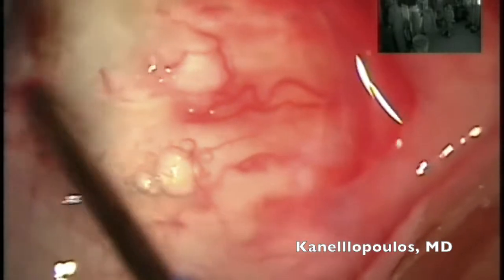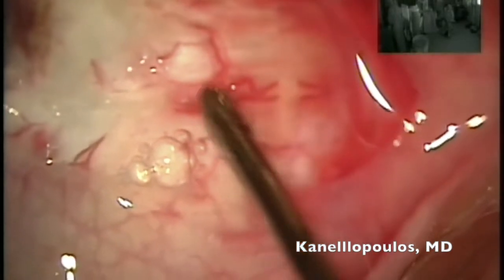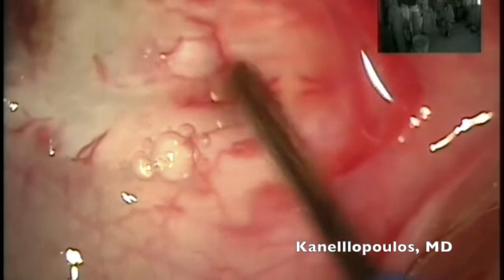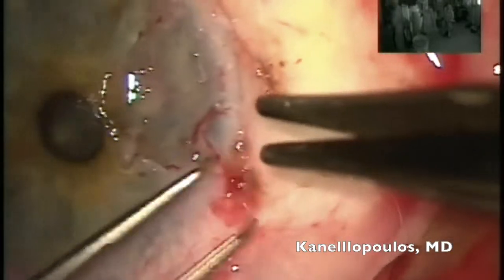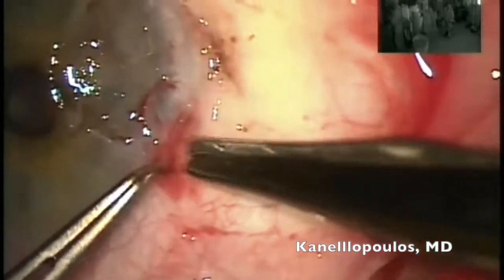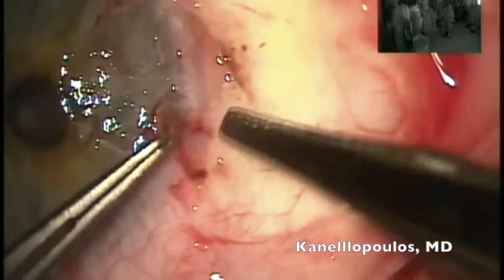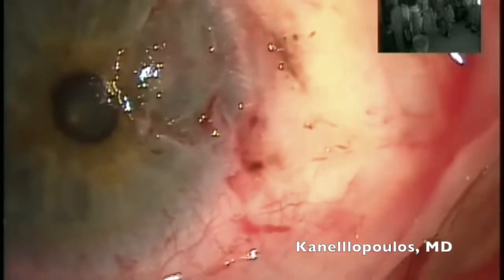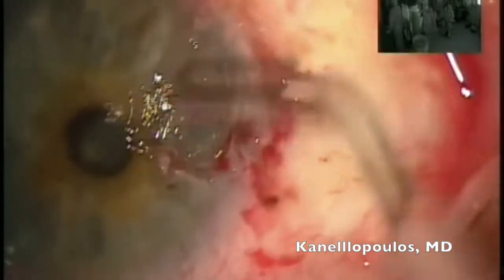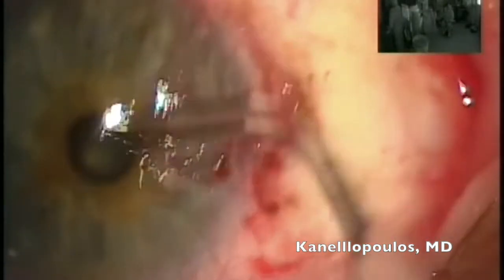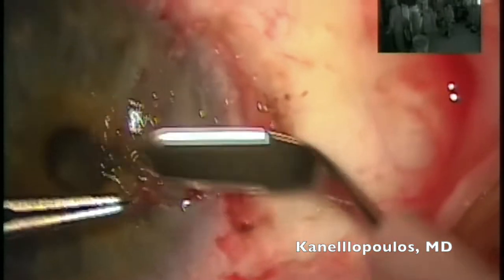We're going to use cautery carefully here as we're very near — you can see the medial rectus there. I'm just very briefly touching those vessels; I don't want to nick one of those and have a very messy field. I'm going back and trimming all the irregularities left over. It's very important for uneventful healing to have a very smooth surface. Good hemostasis is accomplished with bipolar cautery. I'm using a crescent blade to manually smooth the irregularities left behind by the pterygium head.